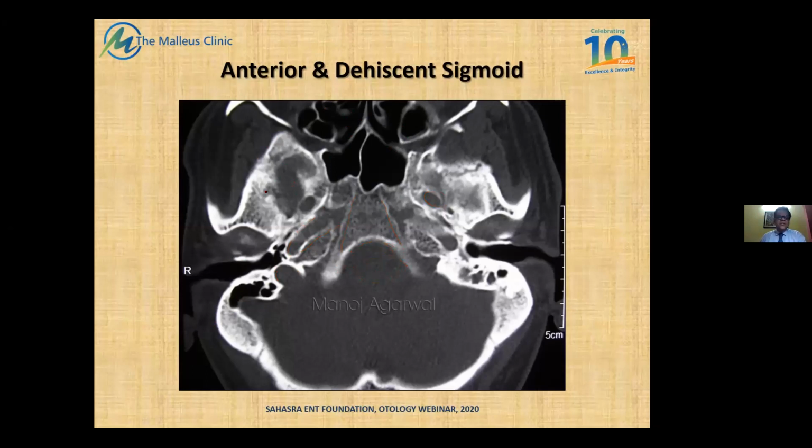More importantly, how thin the tympanic bone is anteriorly. Remember, I repeatedly keep mentioning it simply because while doing a canalplasty, you must be very careful.